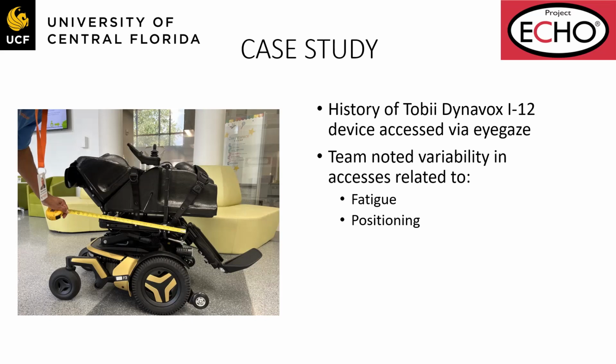And he was having a lot of difficulty with access. He really wasn't accessing the device successfully very frequently at all. The best place for him to access his device was in his prone stander. He was most successful there, but even within the prone stander, it was really dependent on his fatigue level, weather, and tone, and other medical issues that might be occurring in the moment, whether he could access.